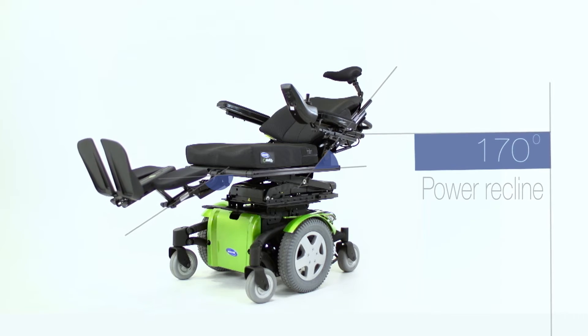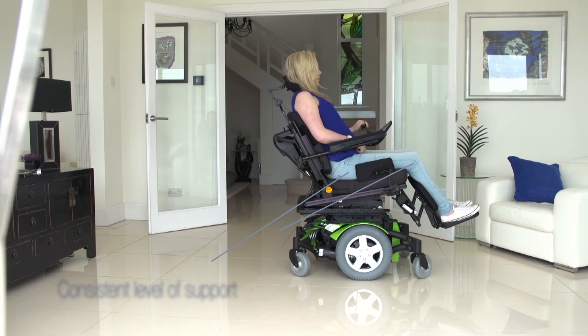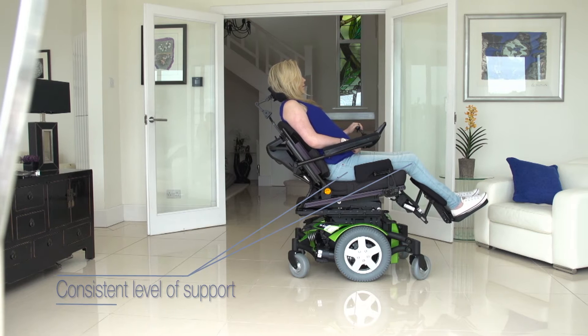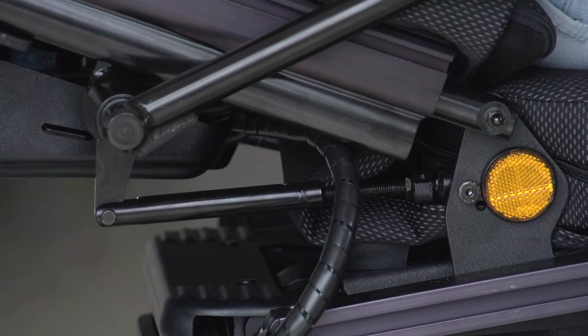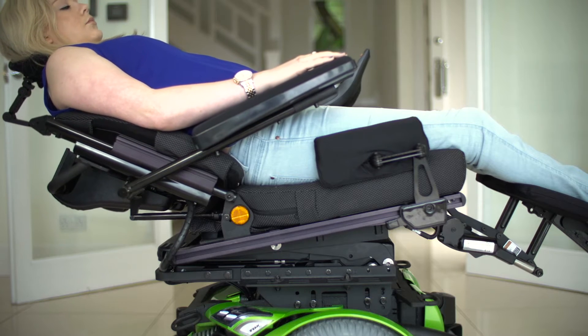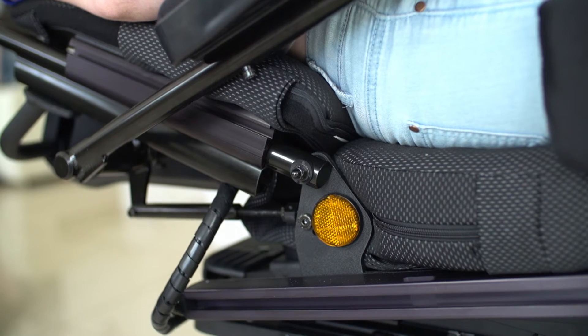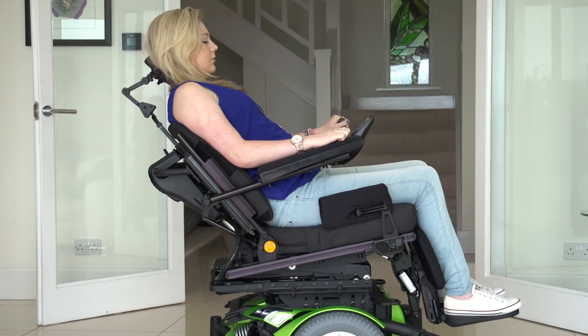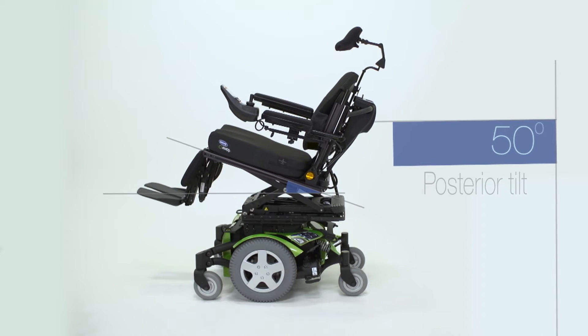The key design aspect of the Ultra Lomax is the 170-degree power recline module, designed to work in harmony with the body's natural pivot points. The extended shear reduction technology combined with the raised pivot point and the specially integrated backrest prevents individuals from sliding down the chair, keeping them stably positioned throughout the entire recline cycle.